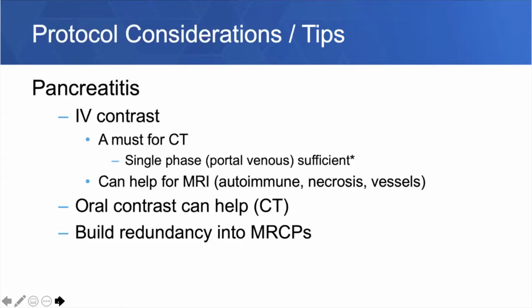And then one other recommendation with regard to imaging of pancreatitis: when you do an MRCP, magnetic resonance cholangiopancreatography, it's just an MRI designed to look at the pancreatic ducts. But those are the protocols you're going to be doing here. Build redundancy into those. Those are difficult exams to do well and to do right. And so if your radiologists are on this, they're going to be building in additional sequences to give you multiple opportunities to look at that pancreatic duct to make sure that on your one go, you don't miss it.